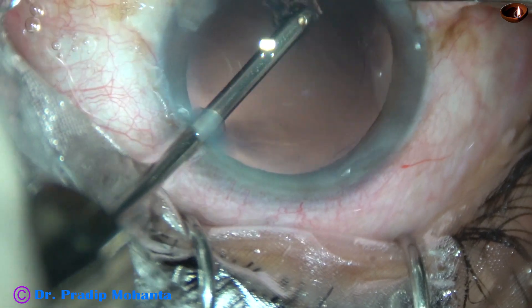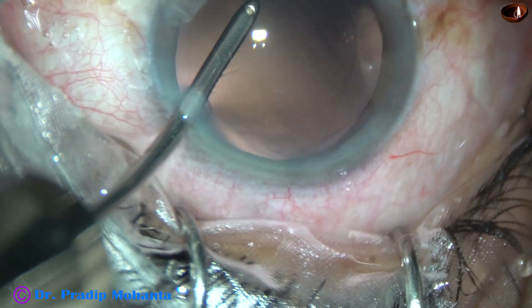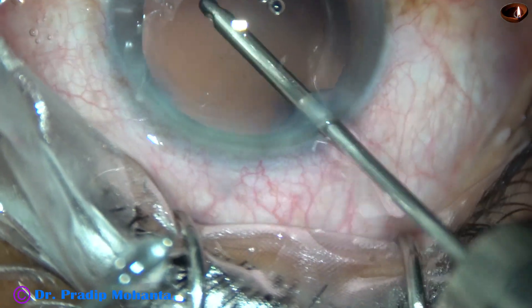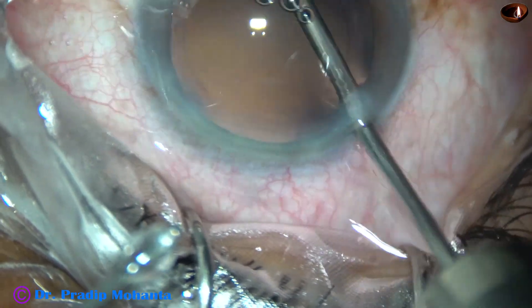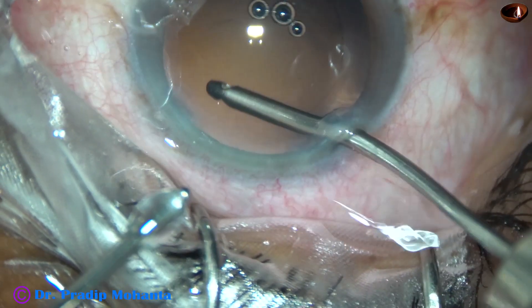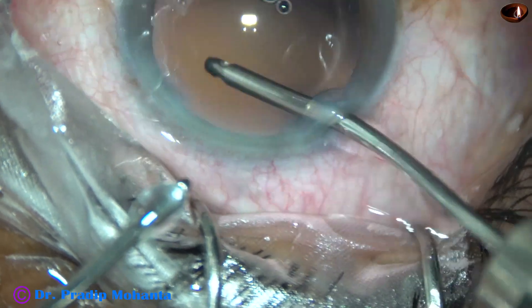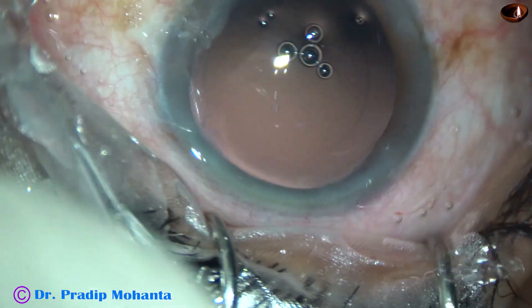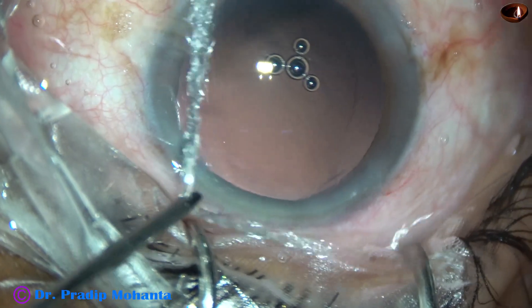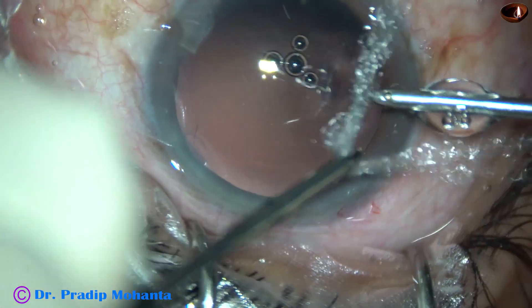So, we have to keep an eye on that. In this case, this didn't happen. The zonule was okay. And this is hydropolish — the cortical cleanup has been done very nicely. There is a lens fiber at the left side port, so I am going to remove that.